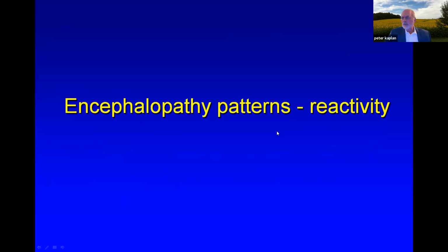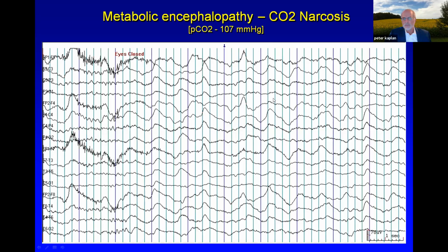Now, the important thing, as I said before, is the reversibility of the etiology of the coma. And that is reflected in the EEG, in which you get reactivity. In other words, if you stimulate the patient and the brainstem is in contact with the cortex, the EEG is reactive, and it shows that you haven't damaged widespread areas irreversibly of the neuraxis, or even reversibly.